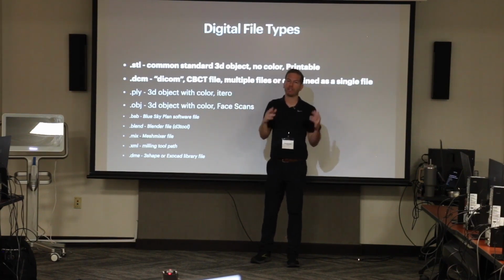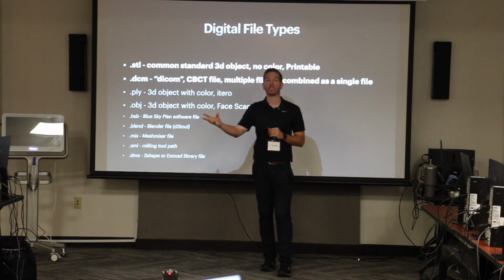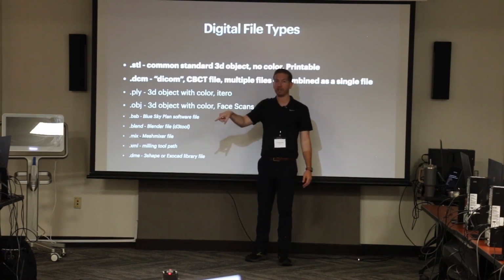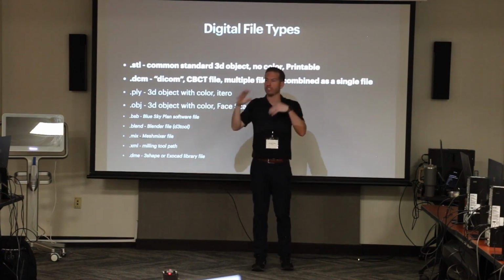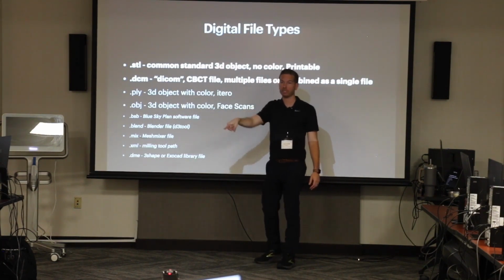What you really want to think about is more the terminology export. So there's a difference between saving and exporting. And when we create something and we want to take it into a printer, we want to think export, not save. So get that into your head, because when you're in Blue Sky Plan, you hit File Save, you're saving a .bsb. And you can't drop that into a printer. That's a BSB. If you double click that, it's going to open up Blue Sky Plan and all the stuff that you designed. If you hit File Export, that's going to save as an STL. That I can drop onto my printer.